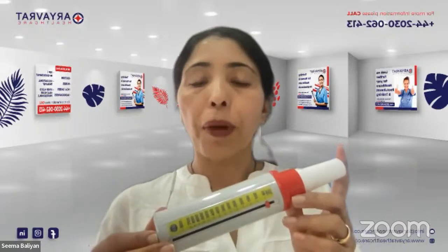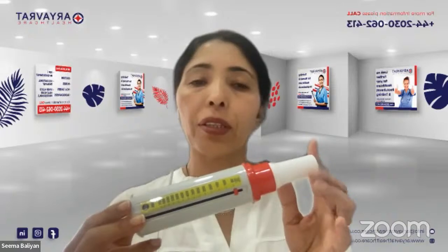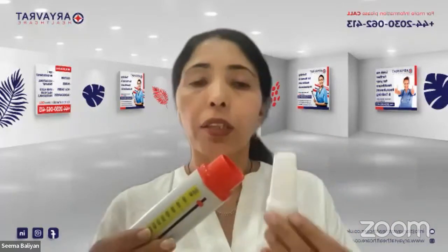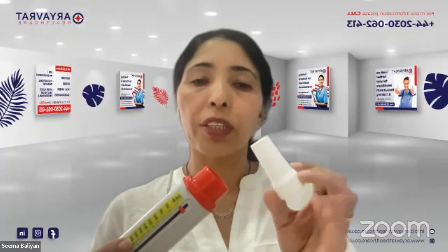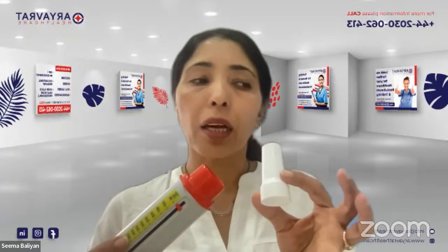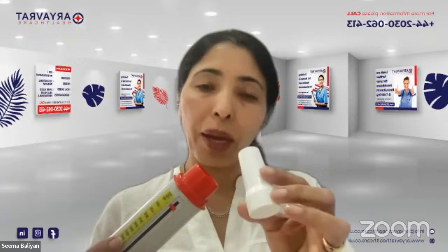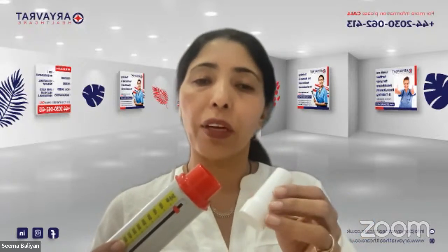Now we come to the third part of it, what are the parts of the peak flow. So we will tell the patient that the peak flow has different parts. There is a mouthpiece, which is detachable, and it can come in two forms. It can be either a plastic one, which is what I'm holding, or a cardboard one, which is disposable.